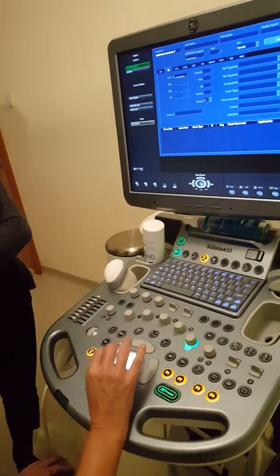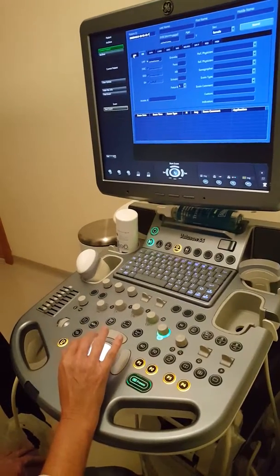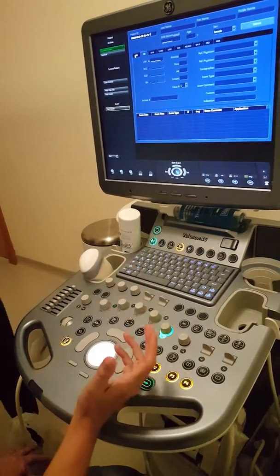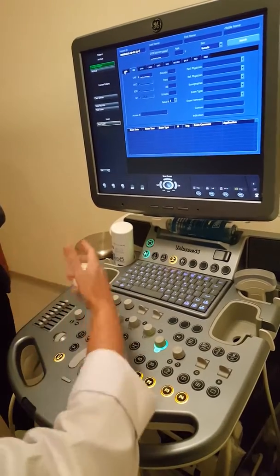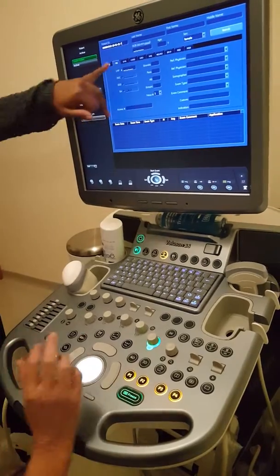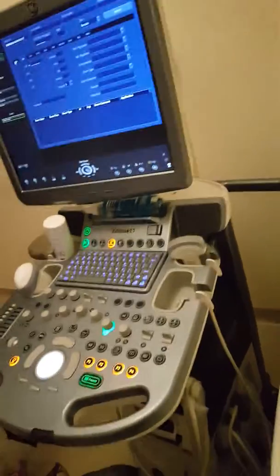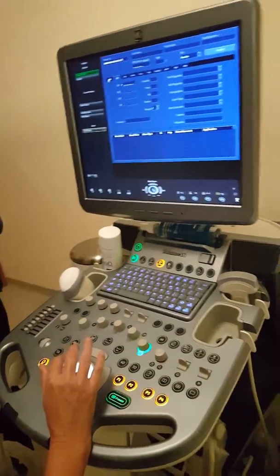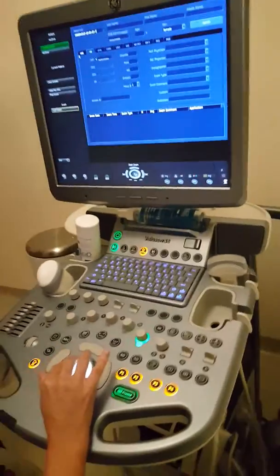Start exam, doctor. Because I can also choose abdomen. Imagine I have a suspicion. Sometimes fibroids are too big for my transvaginal, and then you can use abdominal. Still gynae. Anything related to the uterus, ovary, gynae, you can still do the gynae. So I only use the two buttons, gynae and OB. Yes. I just swipe them as well.